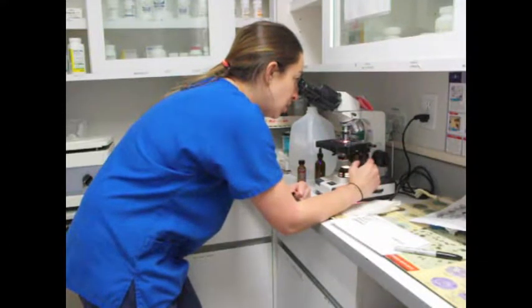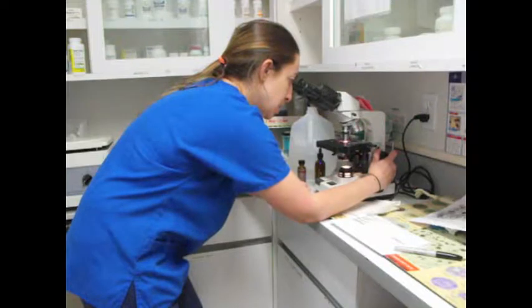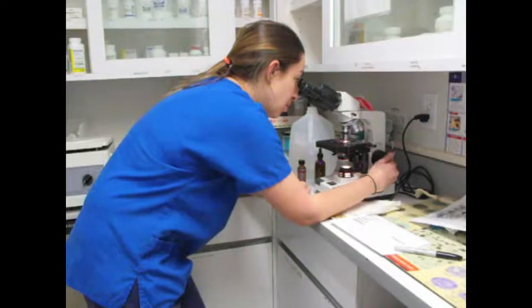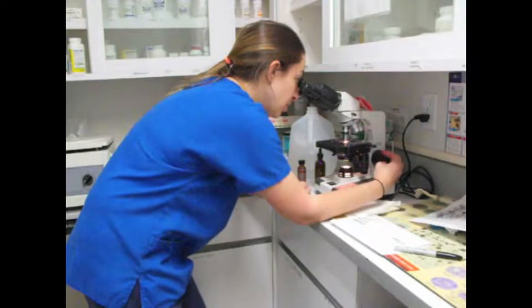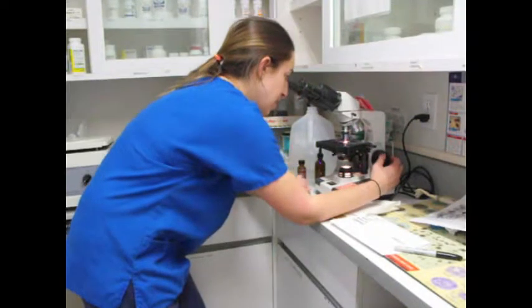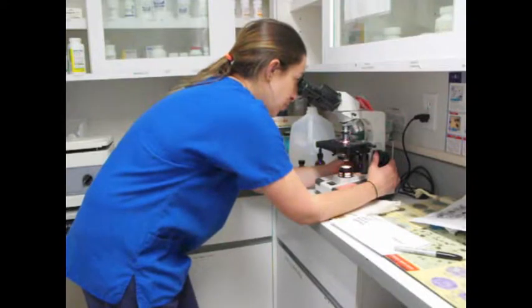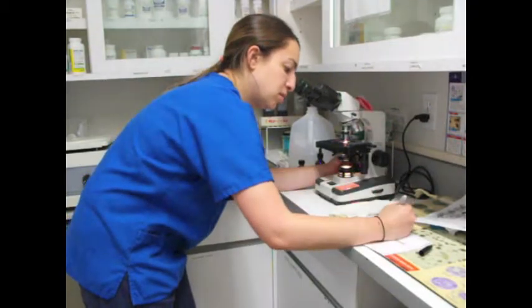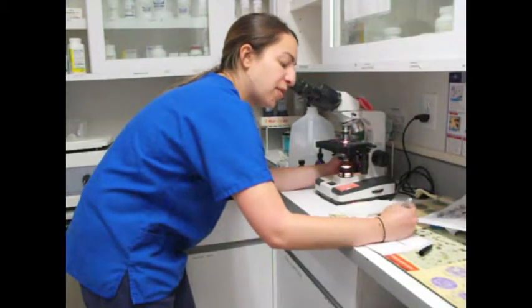I see 1, 2, 3, 4, 5. So I see 5 neutrophils in this field.